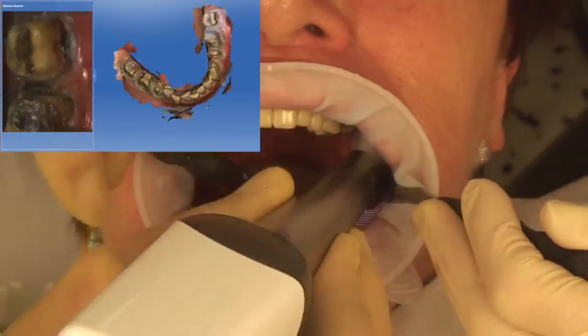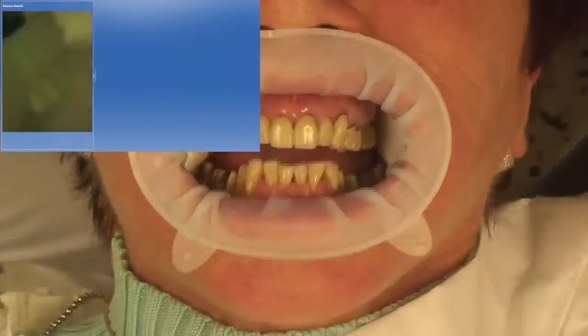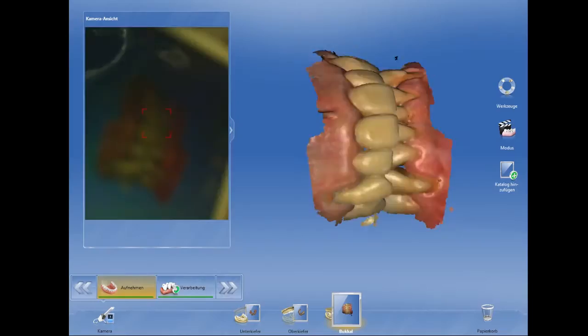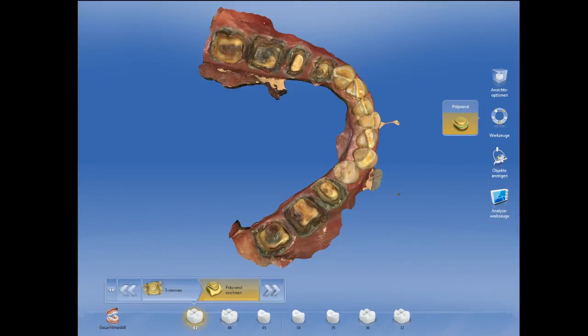After the preparation and drying, we scan in the preparation and then the antagonist and the buccal bite. The images are assigned and then they're ready to be uploaded into the Connect portal.